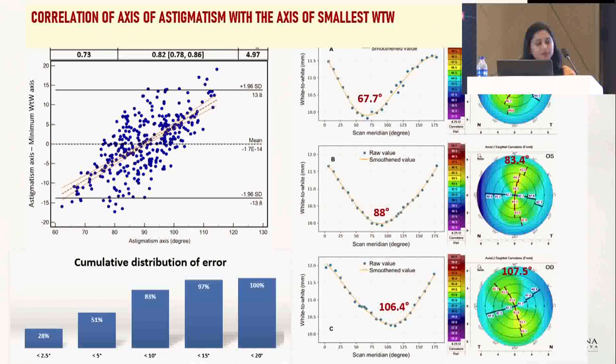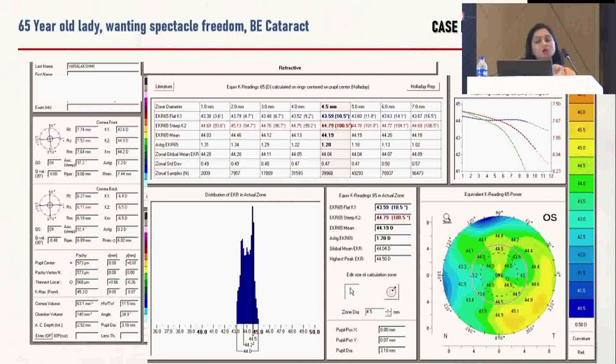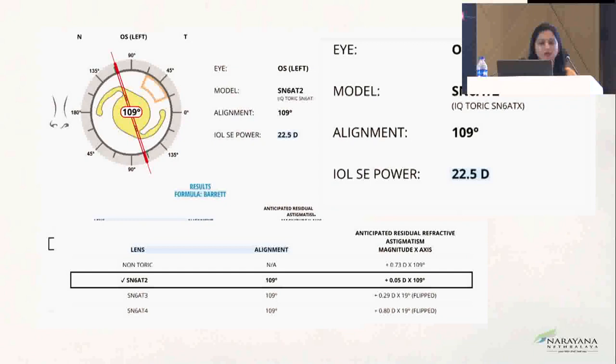So coming to a case example about these calculators, this is how it is. A patient comes with cataract. We do a detailed evaluation, we do a calculation, get the topography done. Once we put all the values in the online calculator, you can choose your lens. Whatever lens you choose, you need to put in that particular company's IOL calculator, and you can see that it is comparable to your IOL Master values also. Once you do that, you place the lens, and this patient was 6/6 vision, and this was T2. We had placed Alcon IQ. Thank you.